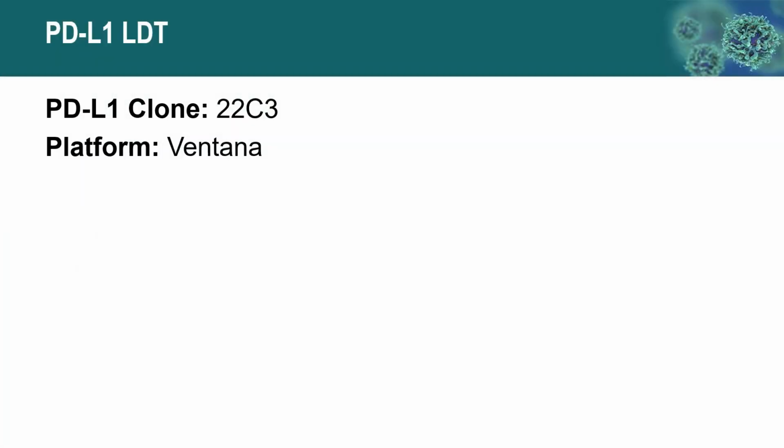So at our institution, we use Ventana systems for our stains, and we use all of our PD-L1s as lab-developed tests utilizing clone 22C3. We've been doing that in lung cancer for at least probably 6 or 7 years, and we do that reflexively. And so every new diagnosis of a lung cancer, I should say of a non-small cell, we reflexively order PD-L1 testing. And more recently, we have brought in PD-L1 testing for our gastrointestinal tumors, as well as our gynecologic, mostly cervical squamous cell carcinomas.